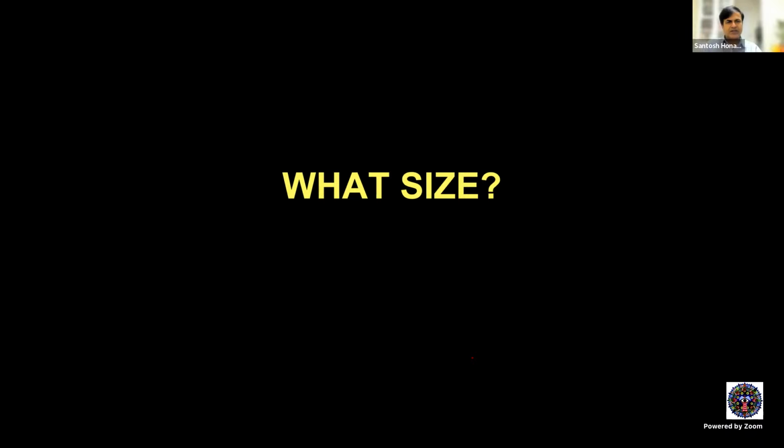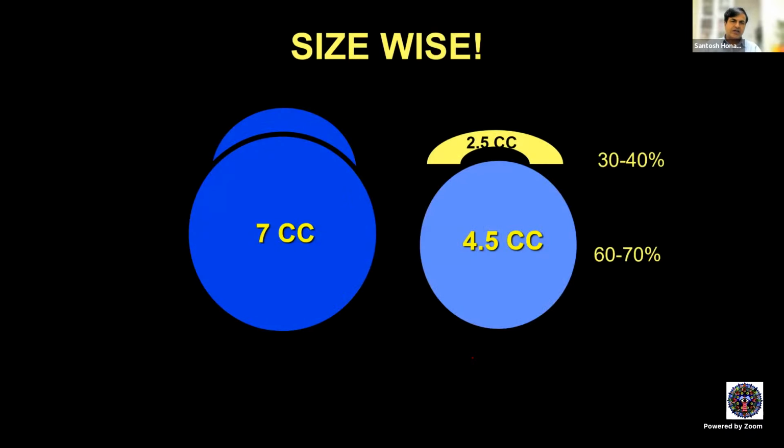You can't measure axial length of the enucleated eye, right? Easily, because it has a tumor or it is deformed. So you measure the axial length of the contralateral eye, unless the patient is monocular or has asymmetric refractive error. All right. So otherwise, you measure the axial length of the contralateral eye, and this is what we were mentioning earlier: 60 to 70% by the implant, 30 to 40% by the prosthesis. So this is how you measure.